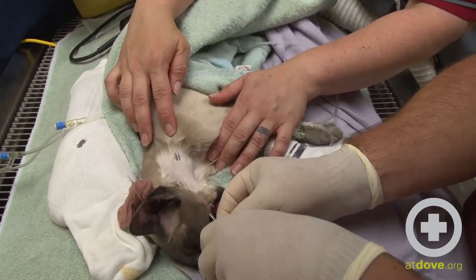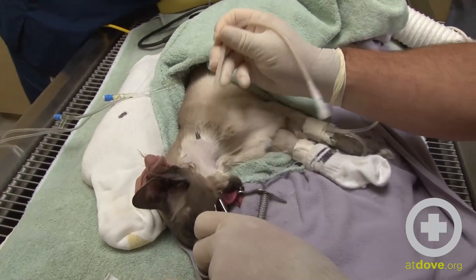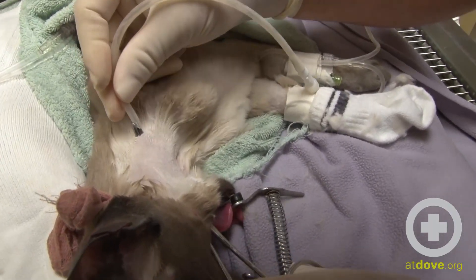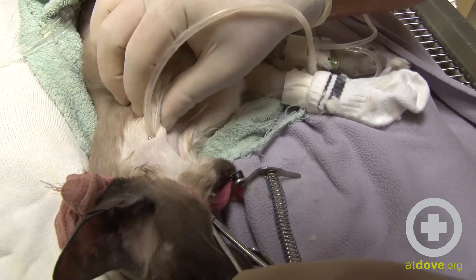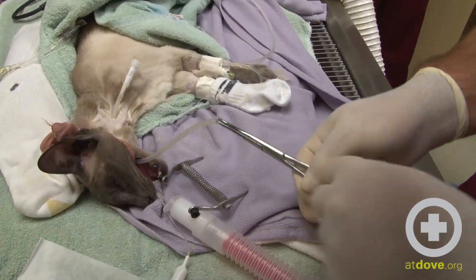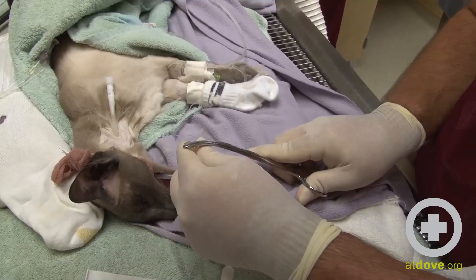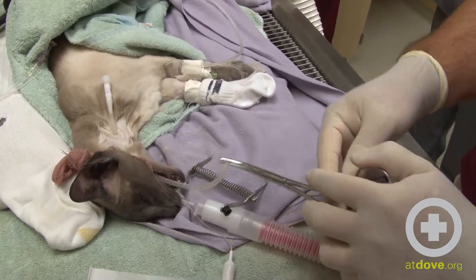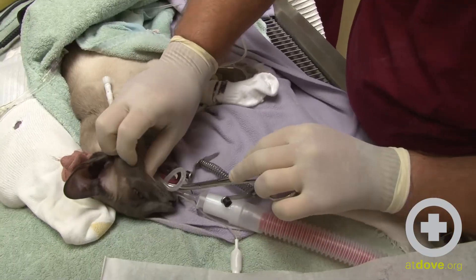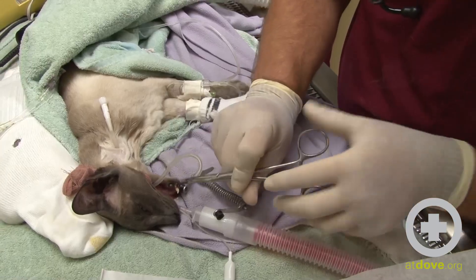A little bit of pressure will allow the carmalts to pop through. After the carmalts have popped through, you can open them up just wide enough to grab your feeding tube and pull it through. Now we have it pulled through. We reposition the carmalts and reverse back down into the oral cavity. As you're passing it along, the end of the tube should flip over, telling you that the tube is going into the correct position.